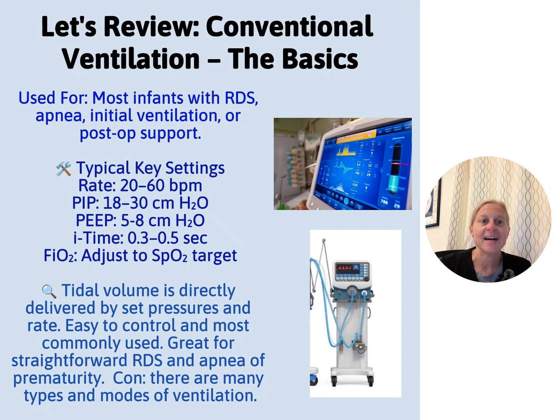So let's dive in. First, we're going to talk about the conventional ventilator and the basics of that. Probably anyone that works in a NICU, even at a level 2, may have had a baby on a ventilator for an hour waiting for a transport team. This is the most common ventilator we're going to see. There are many types of them, as you see down below, and there are many modes of ventilation. We're going to talk about the basics today.